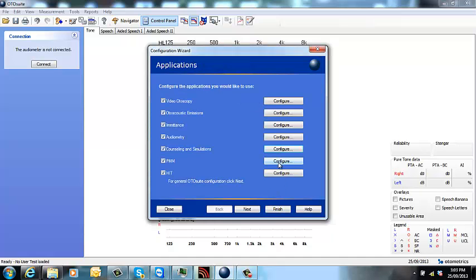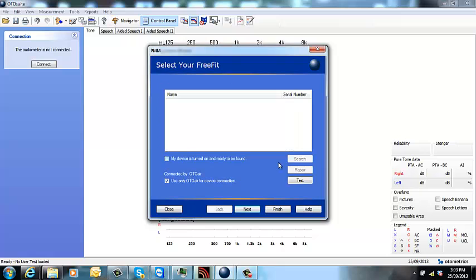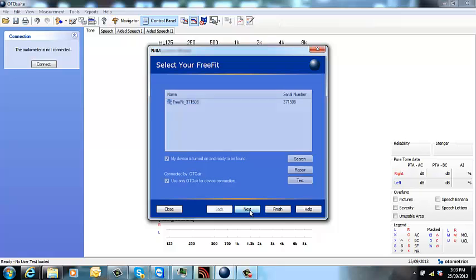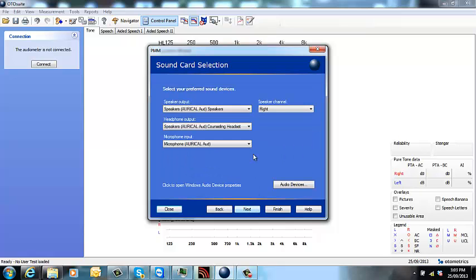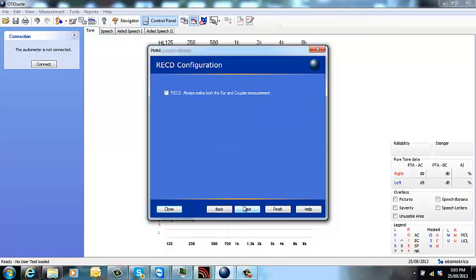And we just need to lastly do the same for PMM. So configure. My device is turned on and ready to be found. Once found, make sure that it's highlighted and click next. It should remember all the settings from what you've just done.